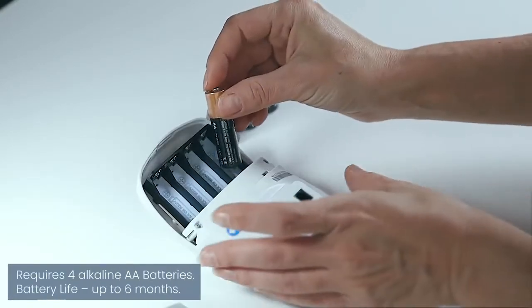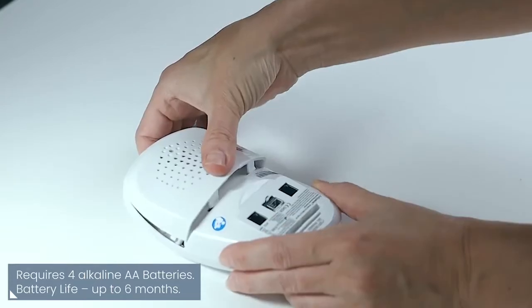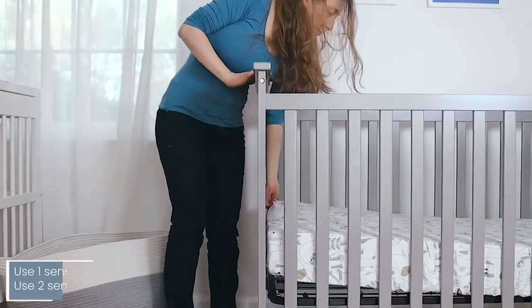The installation is super easy and hassle-free. The control unit is operated with four standard AA batteries and has a long battery life, so no electricity is required.